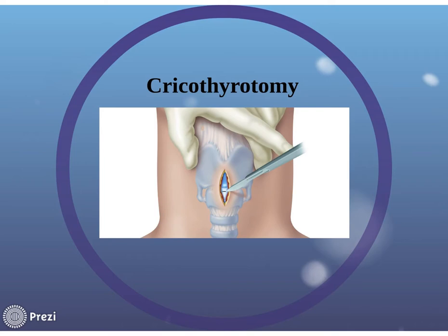That might be a question when you're in a longer case, everything's on maintenance, and the patient's doing fantastic. That might be a good time to talk to your CRNA about whether they have ever done this and where the equipment is. We usually have it in our bottom drawer, and you can ask, if I had to set it up right now, what would I need to do? They would show you, because each place will be a little bit different, and they can teach you that pretty quickly.